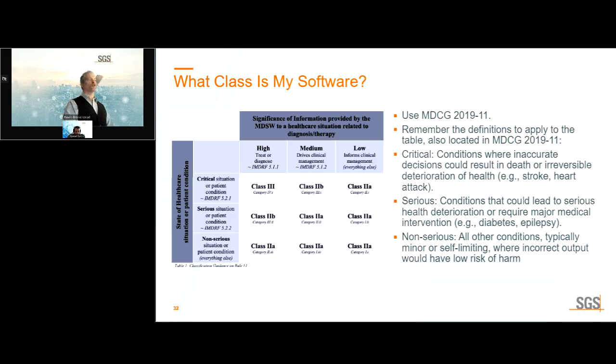The other place, of course, to look that is very important, I like to joke that MDCG 2019-11, which essentially guides Rule 11, could almost be reduced to this table. I'm not saying you shouldn't read the whole thing, but boy, this is a very important table. Remember the definitions inside of it for critical, serious, and non-serious. So they will tell you very clearly where exactly you want to be inside of this. So let's take this definition.